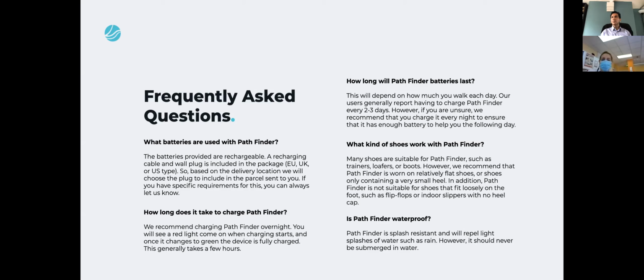Yeah, that was my next one. Cost, I guess, because that's the question we'll get from the patients if we even discuss an aid like that. And is there any funding available for an aid like this? Yes, so the device is €999, and we're actually working with Parkinson's Ireland to see how we can get this introduced through the health system.